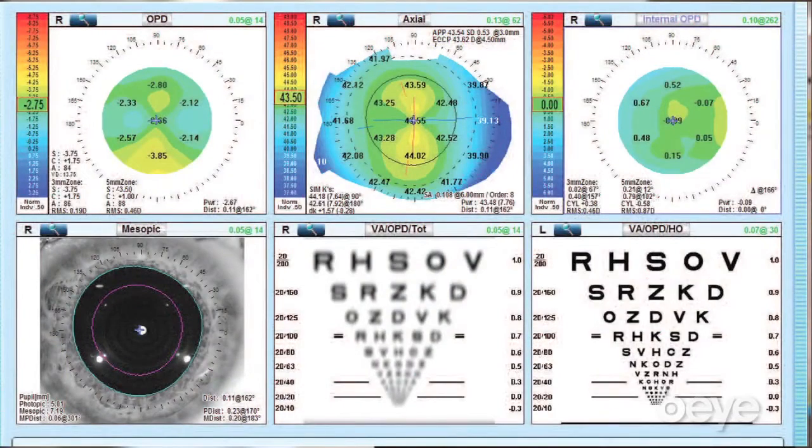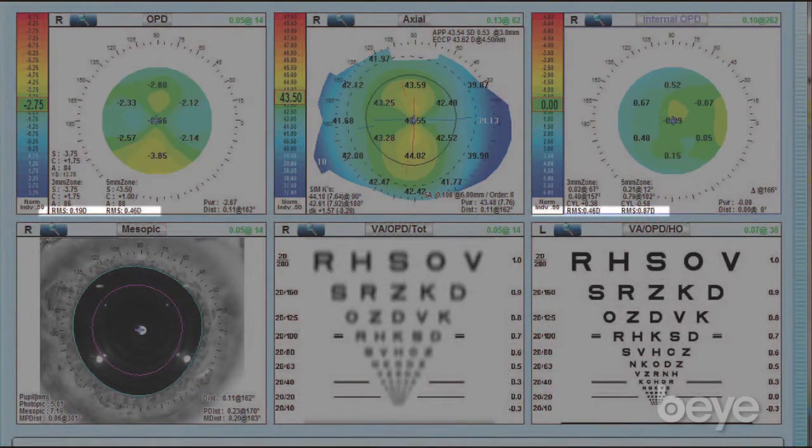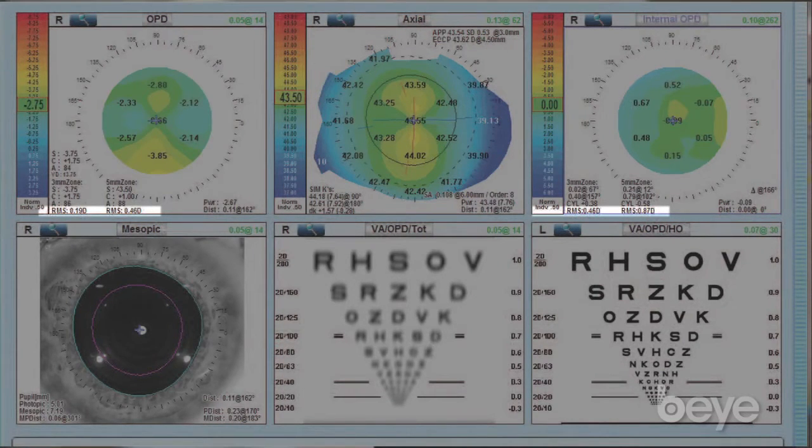The first thing I look at is the root mean square, the RMS value. The RMS value tells me how clean the image is of the light going in and out of the eye. If the RMS value is high, that means the patient's post-operative outcome will most probably not be 20/20 due to underlying pathology — it could be macular issues, it could be corneal issues. It tells the surgeon and the patient that you have to set proper expectations, that the vision may not be 20/20.